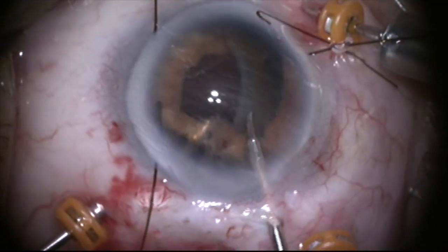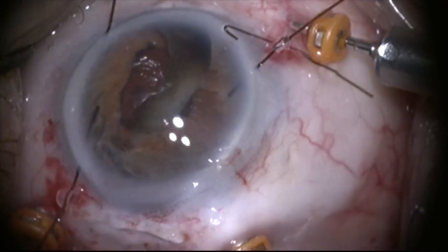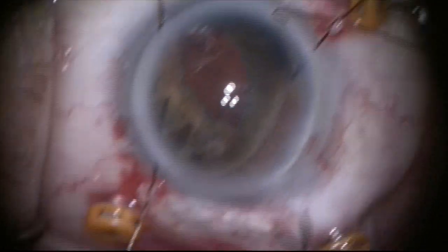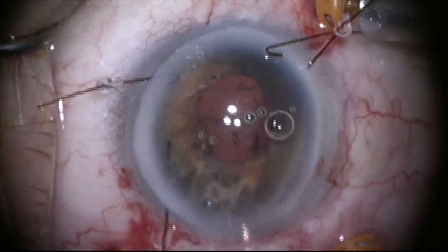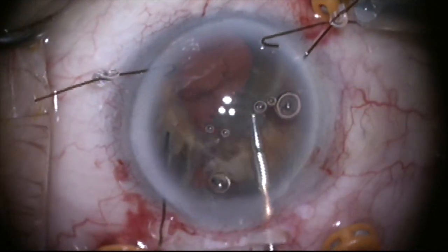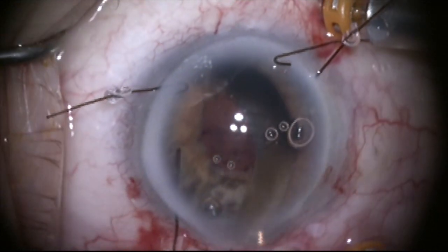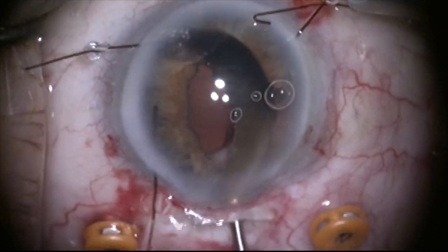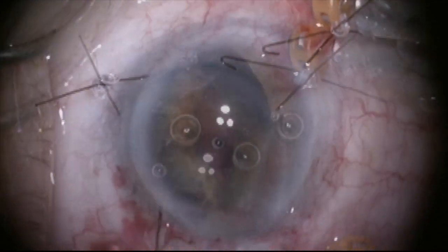Once I manipulate this back up through the iris into the anterior chamber — which is not easy to do — I'm going to put viscoelastic in the anterior chamber and try to pull it out through the main incision, but this is not successful because there's really nothing to grab onto. After trying to flush it out as well, I decide to go ahead and use a fragmentome to break this up.